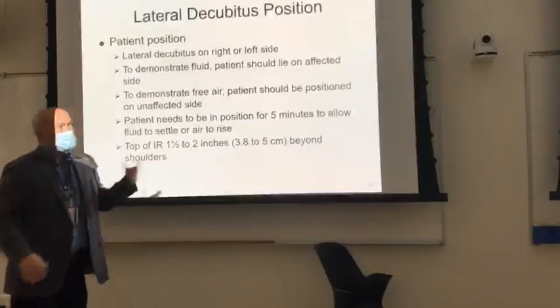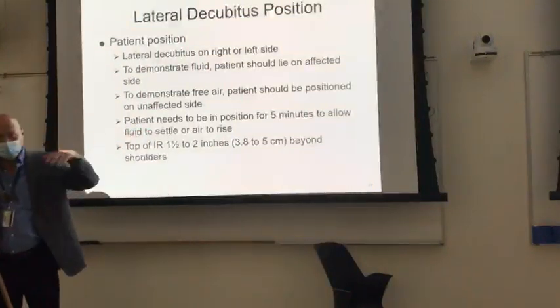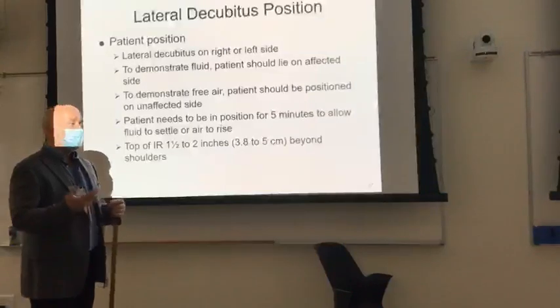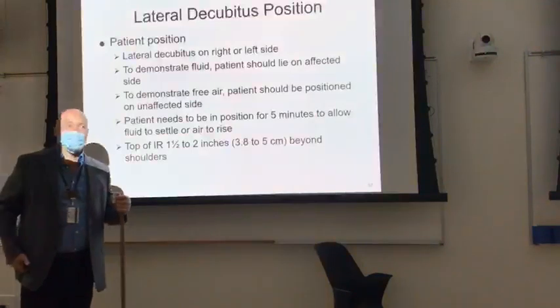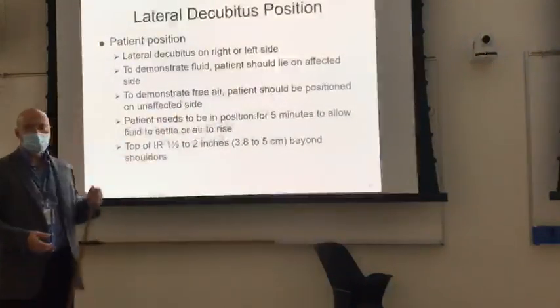So on chest X-ray, we usually get that with the patient upright. But what if the patient can't stand? Well, maybe we can do an upright chest X-ray with the patient on the bed, right? But what if the patient can't sit up? Well, then we have to do a decubitus.